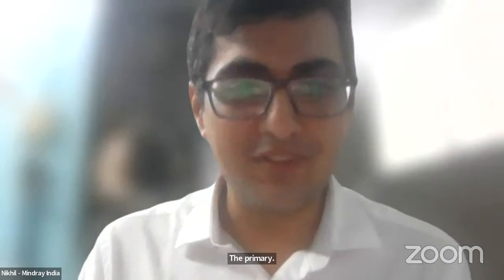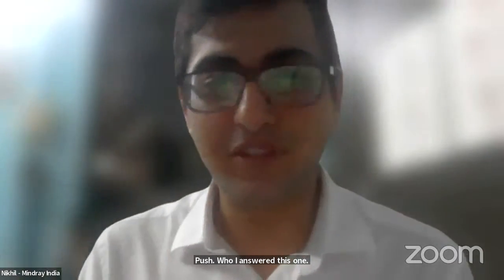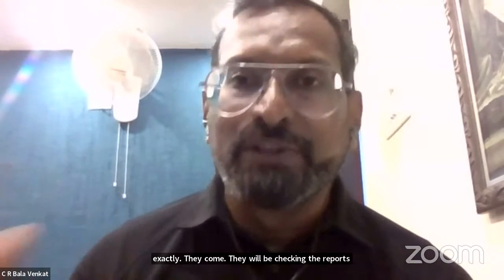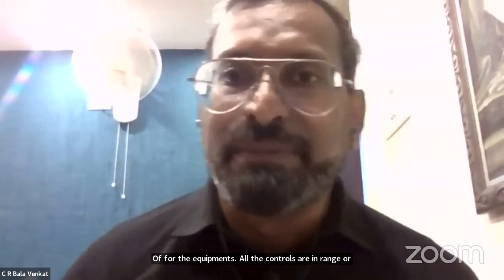Yes, yes, Bala. Thank you. So it's more of supervision for the pathologist. Yes, exactly. They will be checking the reports day to day, whether all the controls for the equipment are in range or not. Then only they will start accepting the results coming from the machines.